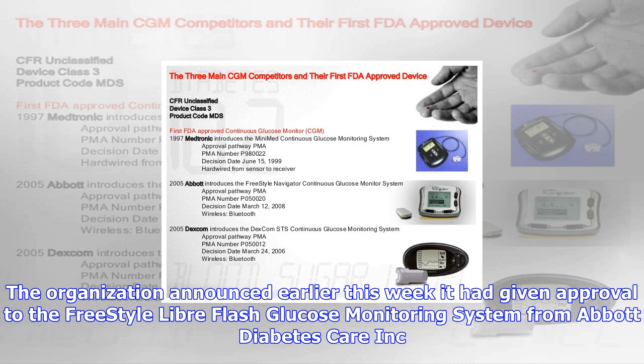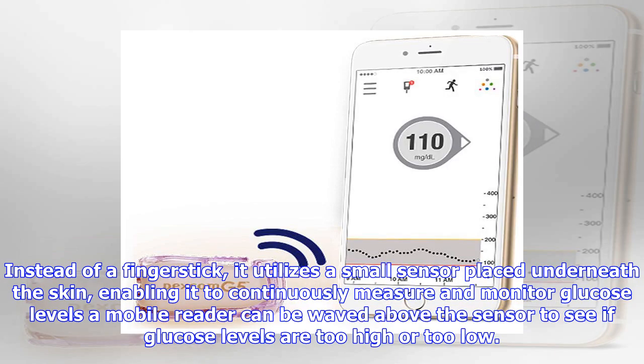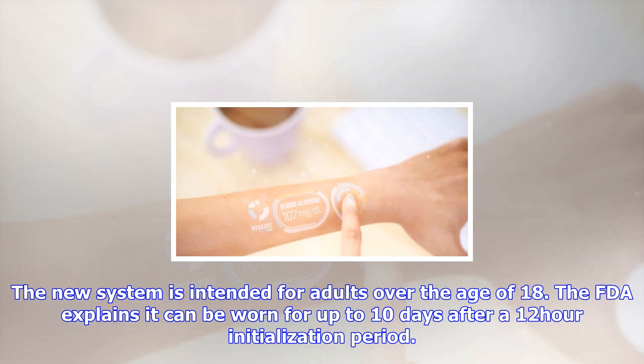The FDA is always interested in new technologies that can help make the care of people living with chronic conditions, such as diabetes, easier and more manageable, said FDA Deputy Director of New Product Evaluation Donald St. Pierre. This system allows people with diabetes to avoid the additional step of finger stick calibration, which can sometimes be painful, but still provides necessary information for treating their diabetes, with a wave of the mobile reader.